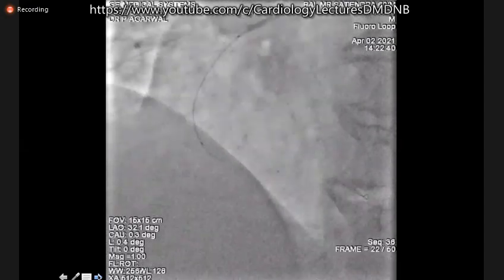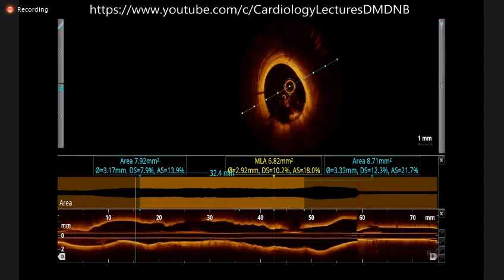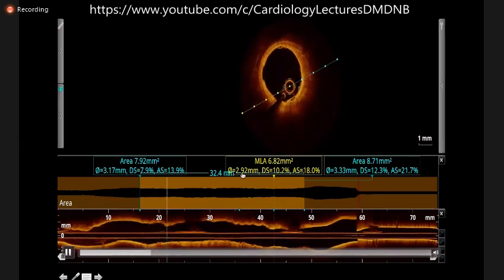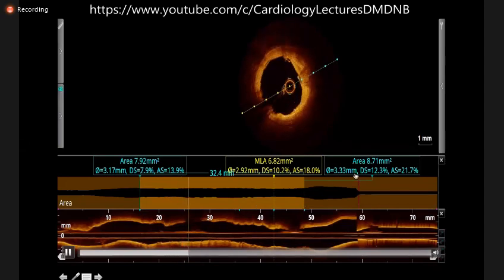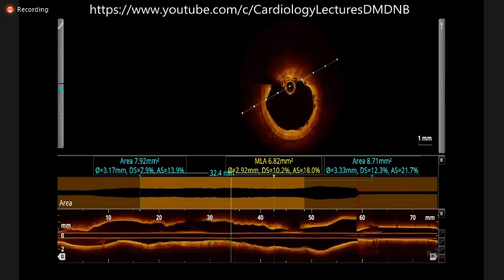And now see the OCT picture. It's really wonderfully well. I'll show you the picture. This area was coming around 5.5. Now it's about 6.82. And the diameter is about 2.92, approaching 3. And these are also 3.17 and 3.33. And you can see the stent is very well deployed, like all along. You can't see any area of under expansion. And I tell you, these devices behave very well if you prepare the bed very well.